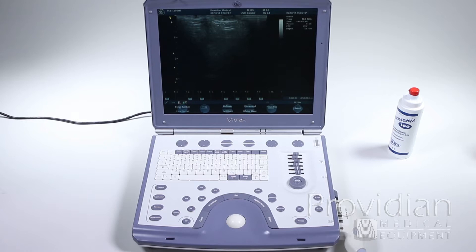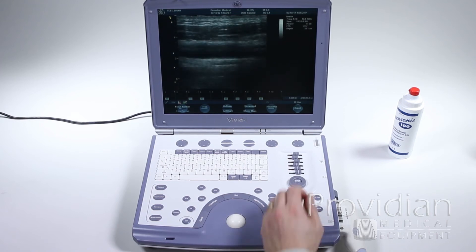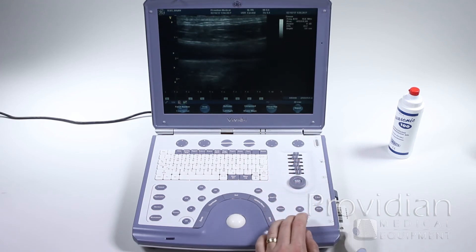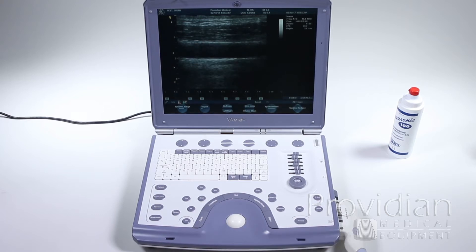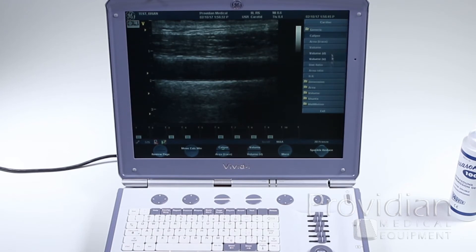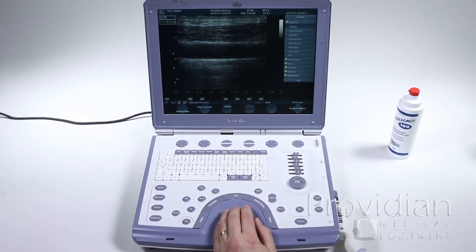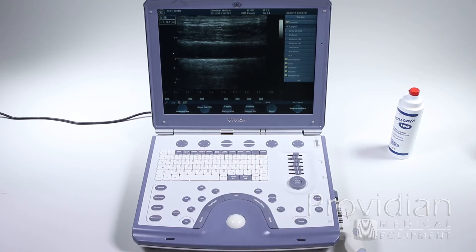For measurements and annotations, start quickly with some basic 2D measurements. Get a quick image up on the screen, then simply freeze and press the measure button. Here you have all your available measurements. If I want to do a quick measurement, I've got the caliper here and can simply click set and make my measurement. Store the image and move on — that is for your most basic imaging.